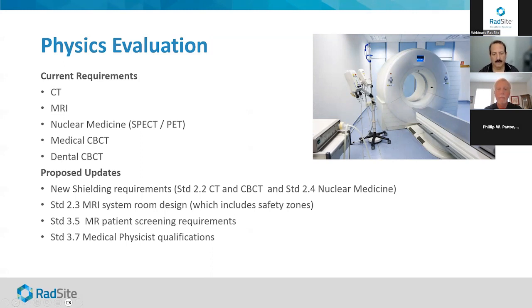So the requirements for the physicist to evaluate are not unique, but they're like, how accurately is the CT number for what we're reading? Are the slice thicknesses accurate? And like I said, CT number uniformity, is the image uniform? Is there a lot of noise in the image that might prohibit the radiologist from seeing what is required? Again, what's the spatial resolution? And then obviously, how well can it detect very slight changes in contrast?